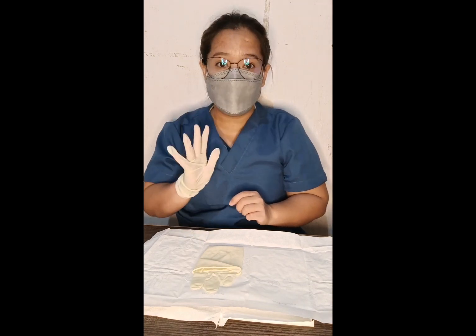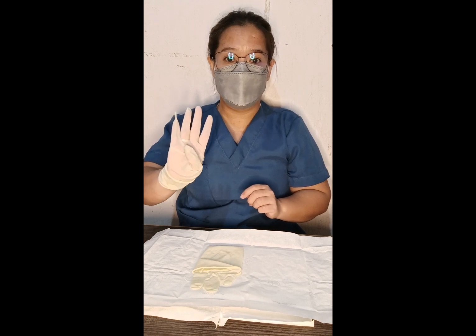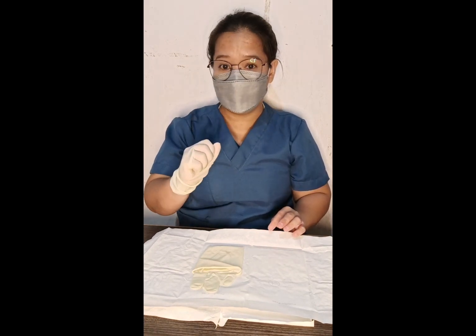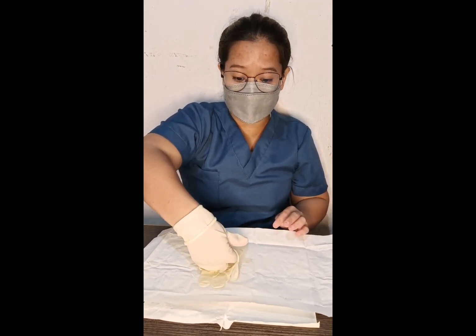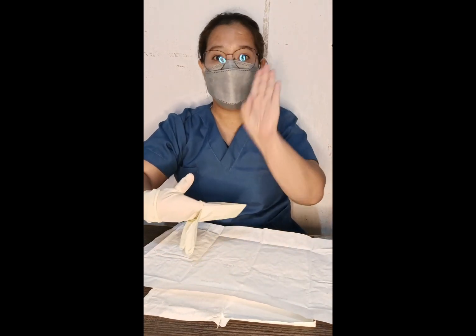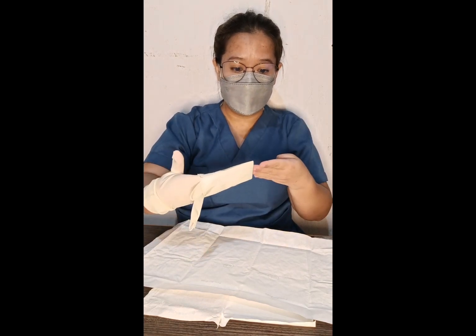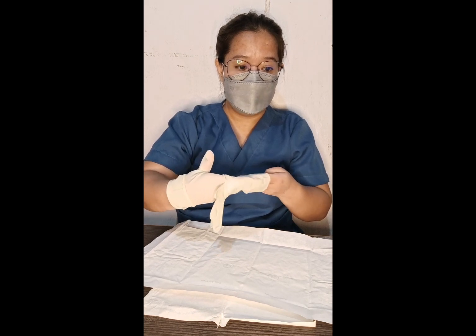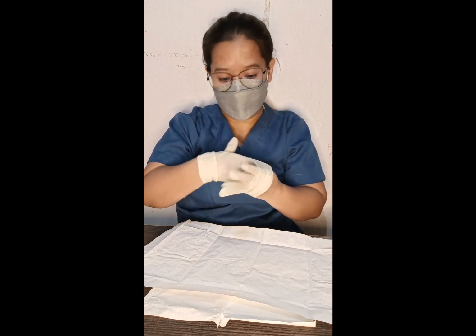Okay. So right now we will be putting on the second glove. Unlike the first one, where we folded the cuff and touched the non-sterile part, since we are already wearing a sterile glove, we will be picking it up like this. We will be touching the sterile part of the glove, and then positioning our right fingers by holding the cuff. So lift, and put the glove over your fingers. The hand that you will be putting the glove on should stay flat. Keep the glove thumbs up and avoid touching the bare palm and wrist.